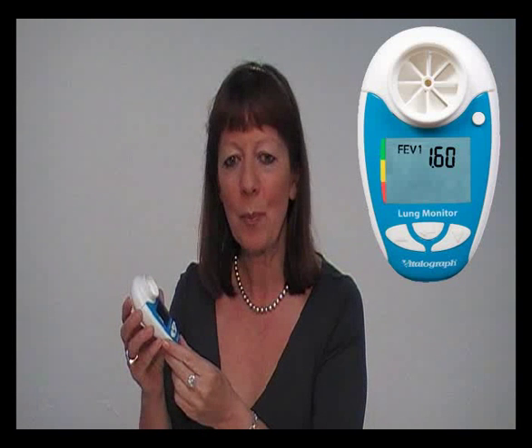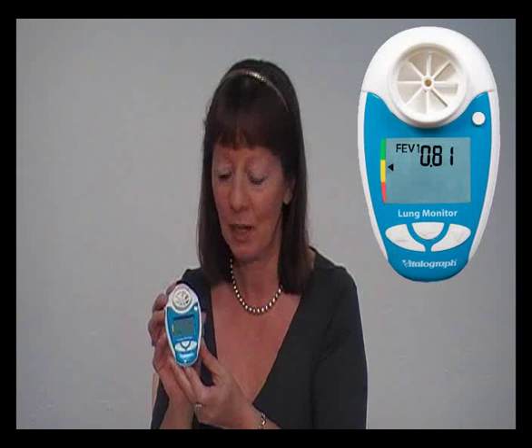When you have your own personal best programmed into the device, after every test it will display an arrow on the left-hand side of the screen to show which colour zone you are in, based upon the percentage of your own personal best. The colour zones can be modified if necessary by a healthcare professional.